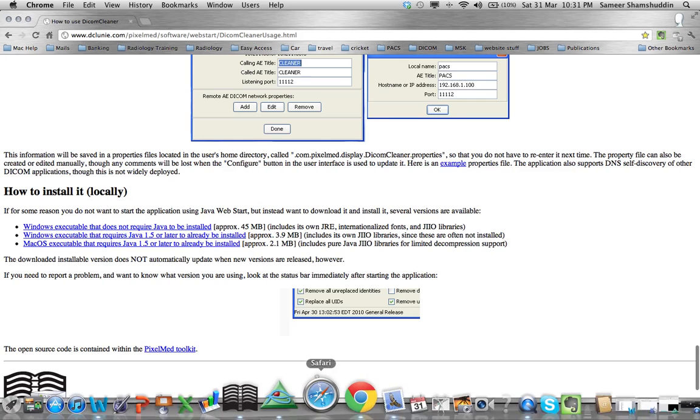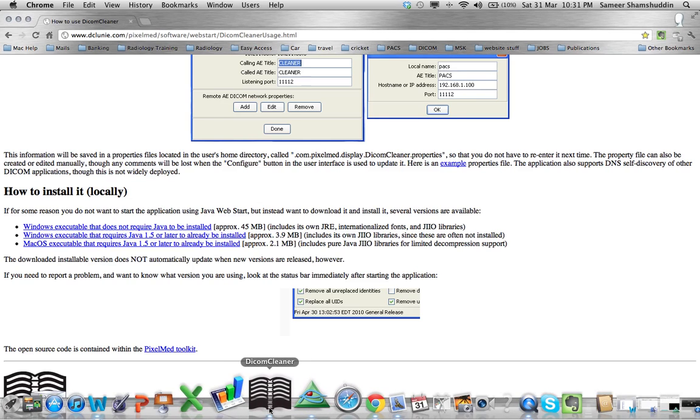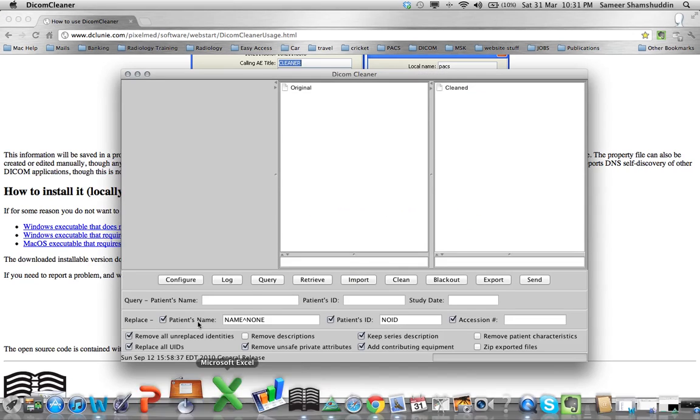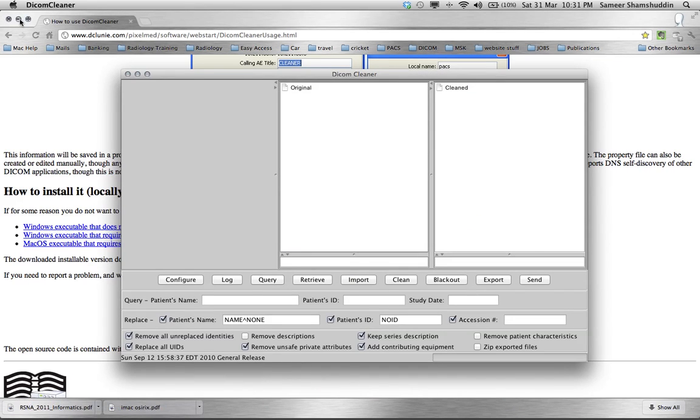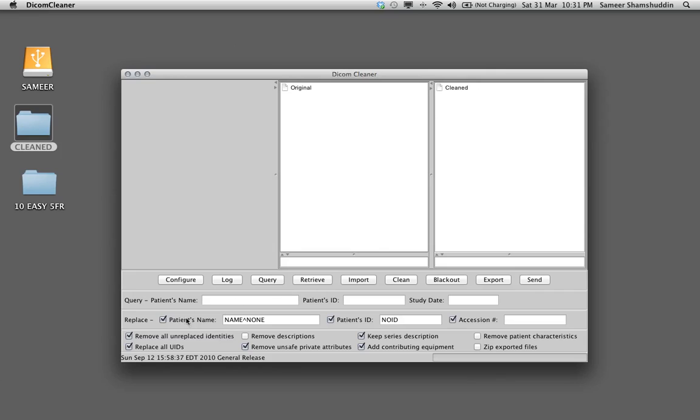Once you click on the dock board and click the DICOM Cleaner icon that gives us this window. This window has got two sections, one workstation wherein it says original and cleaned and then there are multiple tabs and also options.